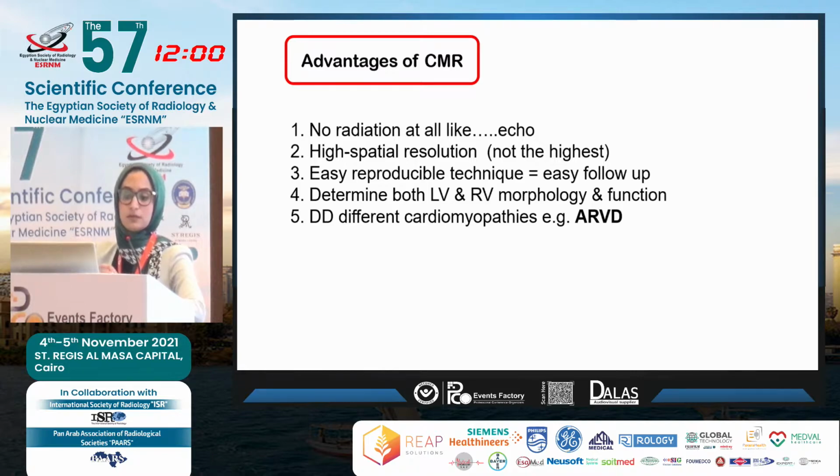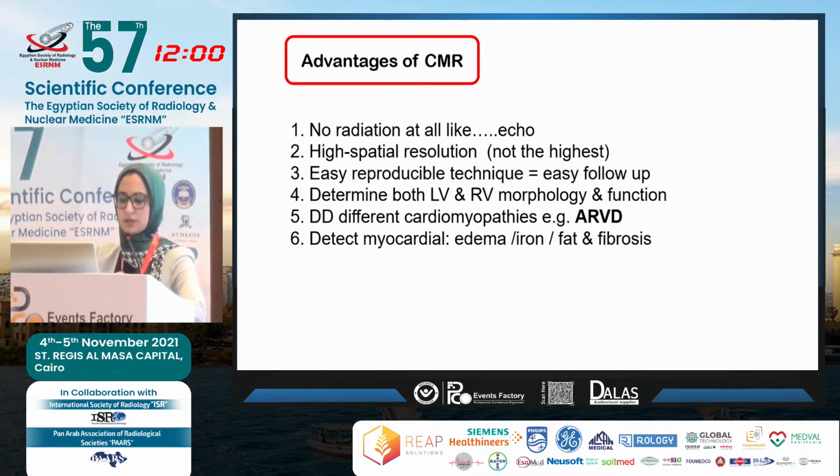Fifth, you get to differentiate different kinds of cardiomyopathy, like we saw. Sixth, it has a very high capability of tissue characterization since we have a very high contrast resolution, so you can differentiate edema from iron, from fat, from fibrosis, and so forth.